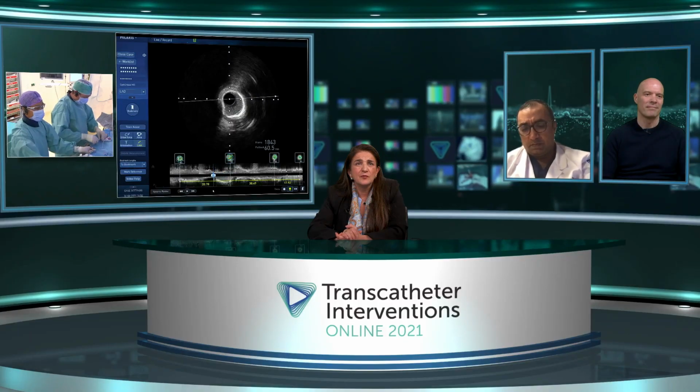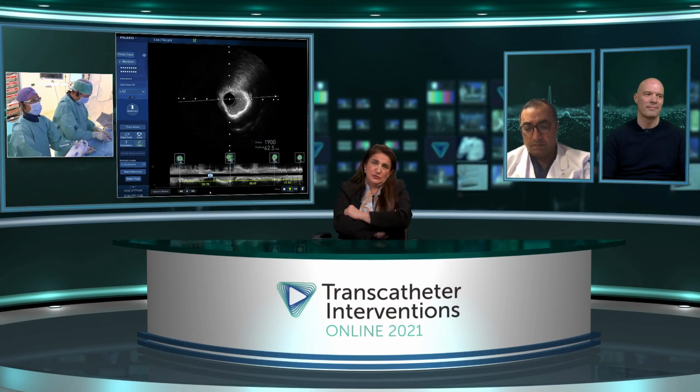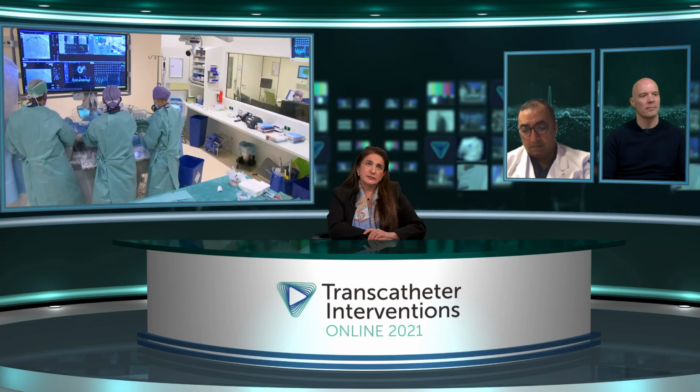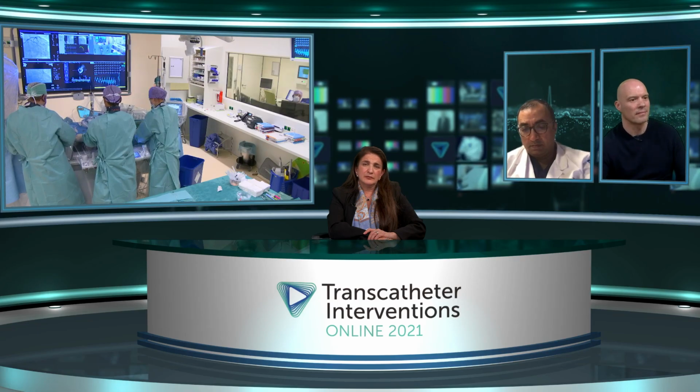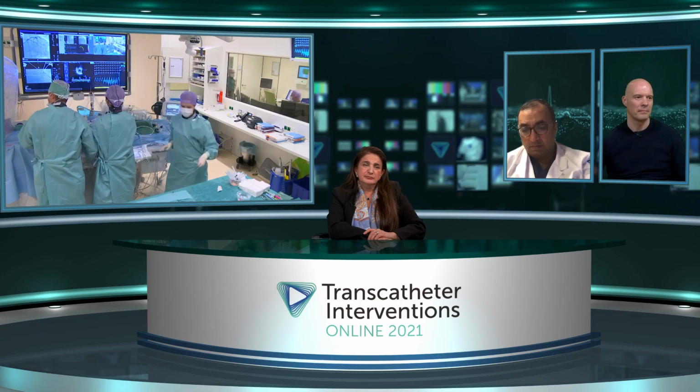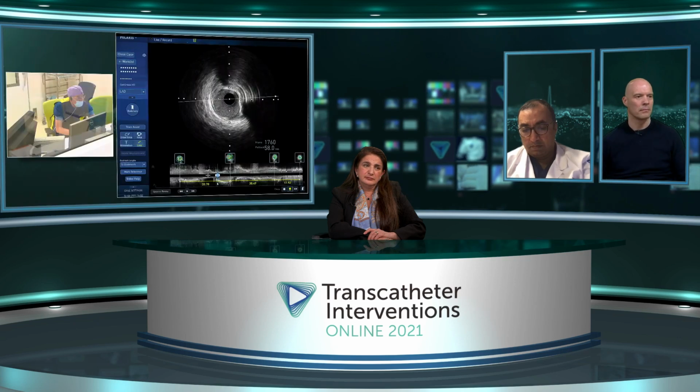Here is the proximal part. Also there we have at 3 o'clock, it's partly blocked by the guide wire, but here we have the crack in the concentric plaque. And definitely in the rest of it, probably we have some cracks, but it's made thinner, and it was good for pre-dilatation.